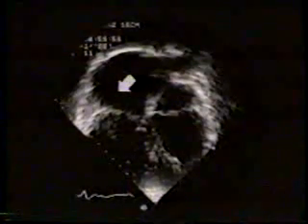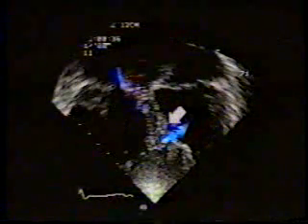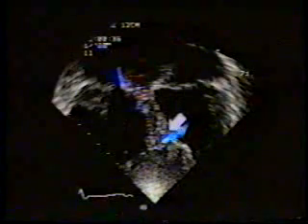This is the dilated right atrium and dilated and hypertrophied right ventricle here. This muscular ventricular septal defect could be clearly visualized on color flow examination with predominant right to left shunt. In real time, you'll see this very clearly and also note presence of tricuspid regurgitation.